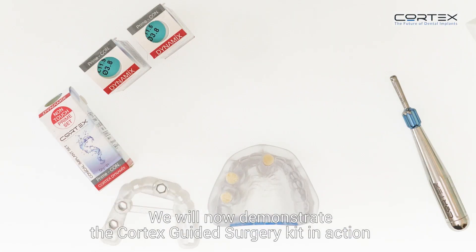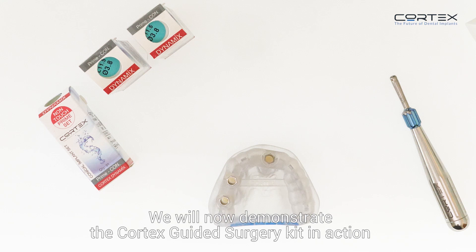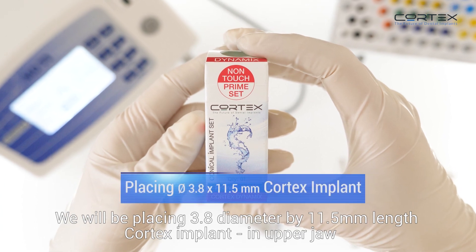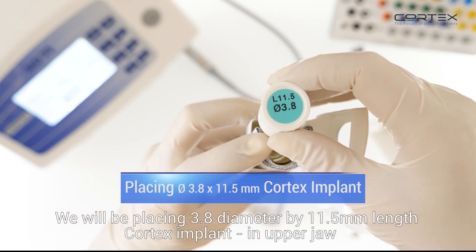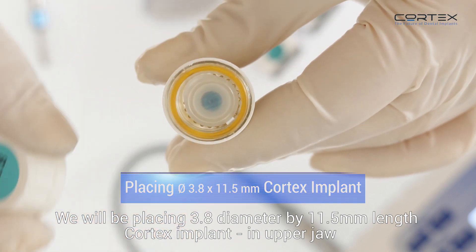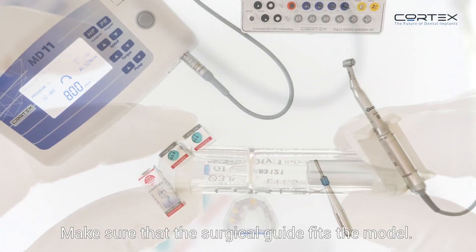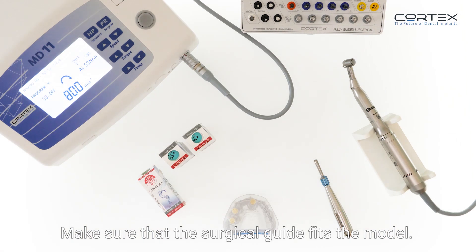We will now demonstrate the Cortex guided surgery kit in action on a one-of-a-kind, unique hands-on model by Cortex. We will be placing a 3.8mm diameter by 11.5mm length Cortex implant in the upper jaw. Make sure that the surgical guide fits the model.